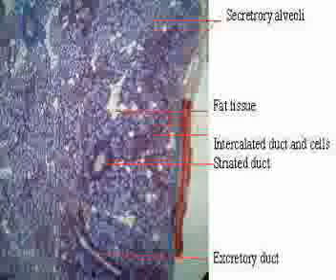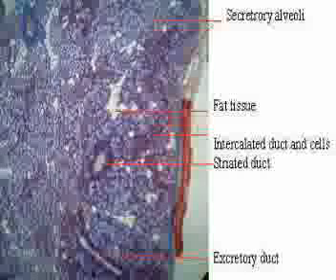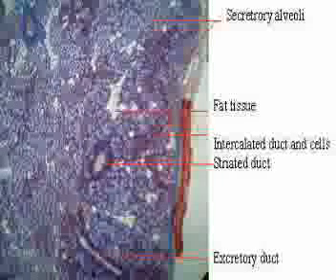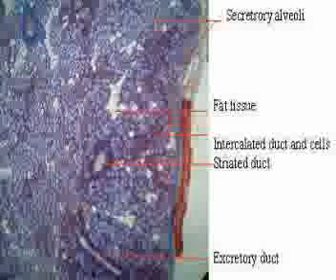Differential diagnosis. Pancreas has acini with secretory lumen, but can easily be made out by the lightly staining islets of Langerhans. Prostate gland is muscular. The muscle fibers are a giveaway. The breast too contains secretory alveoli, but their secretory lumina are bigger than those of salivary glands.